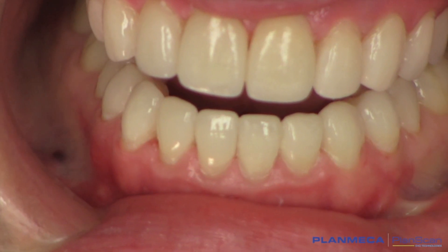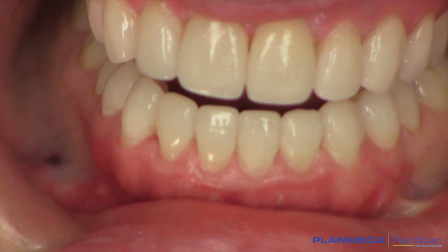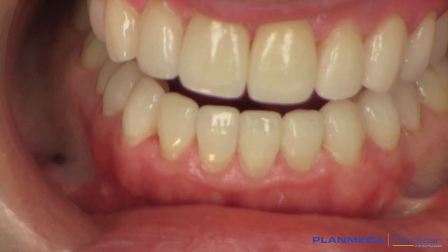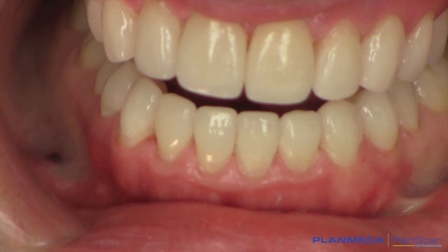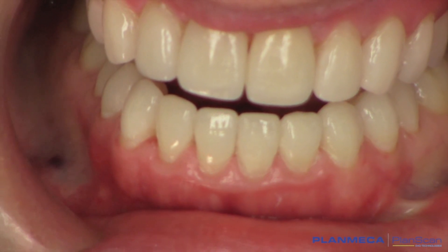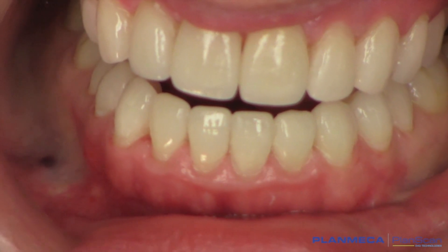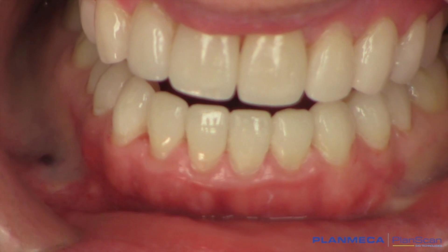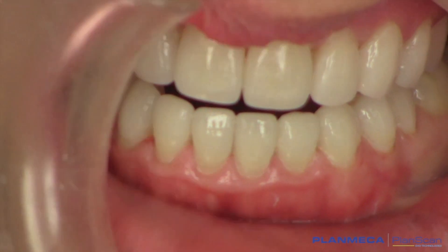We've completed the bonding process. We've placed Emax HTBL3 CAD-CAM restorations on tooth number five through 12, and then 21 through 28, and they look natural. We've got them all cleaned up, the occlusion where we want it — cuspid disclusion, checked in lateral excursives and protrusives — and look how nicely they blend with the tissue. CAD-CAM dentistry from Planmeca PlanScan, PlanMill, and Design are awesome restorations. We bonded these on with Ivoclar Variolink material. Our patient has already seen them, and Lynn is really happy to be done.